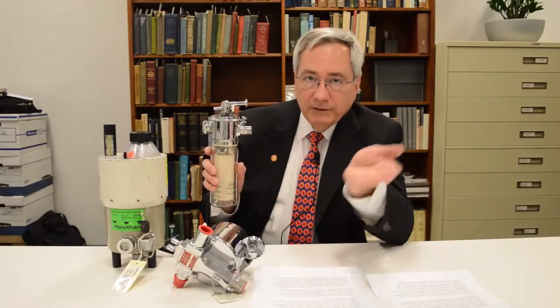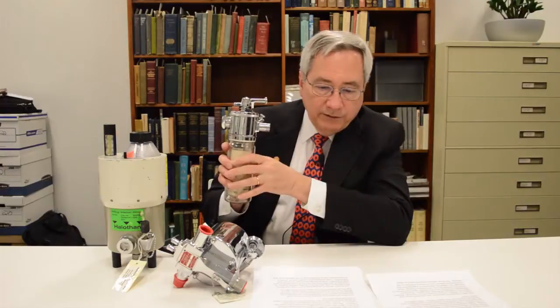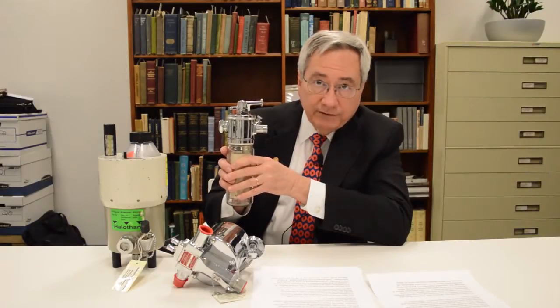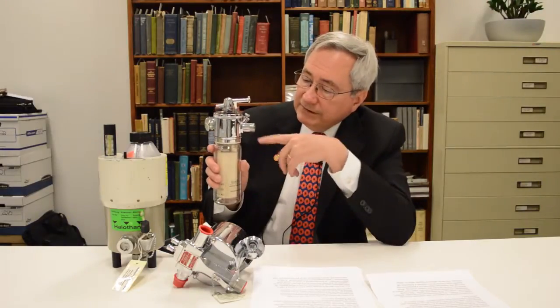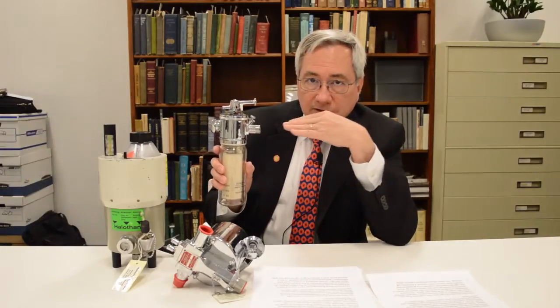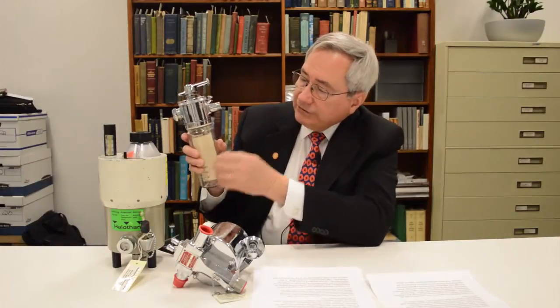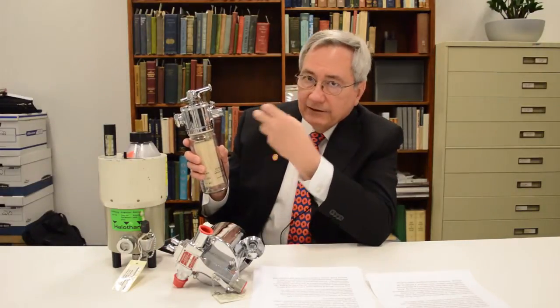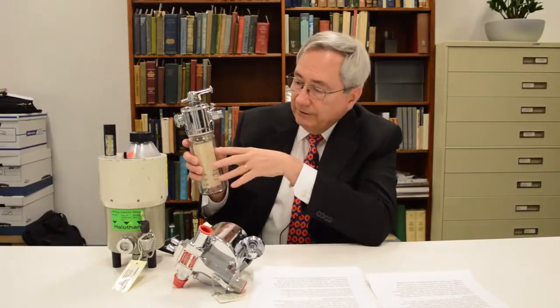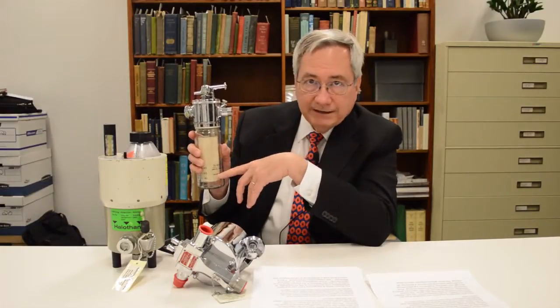So gases that a patient would exhale would come back through and make another pass through here. Now that was important because it had 2 effects. One, since this added anesthetic vapor to it, depending on how much was coming into it, you got different amounts coming out of it. Additionally, as patients exhale, water vapor comes out. This is cold, and so you would get water condensing in here.